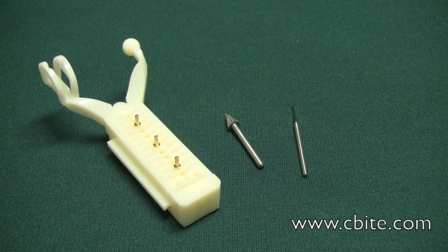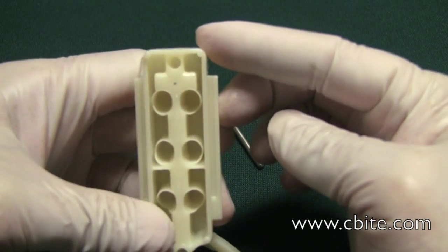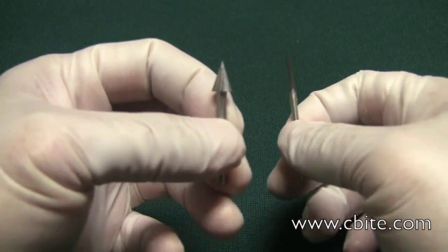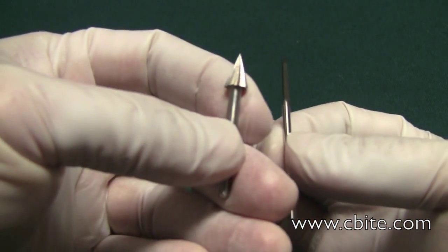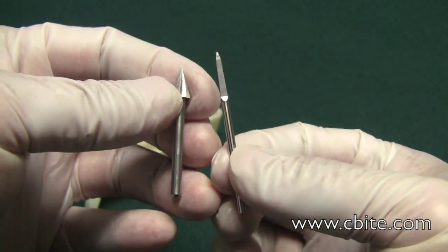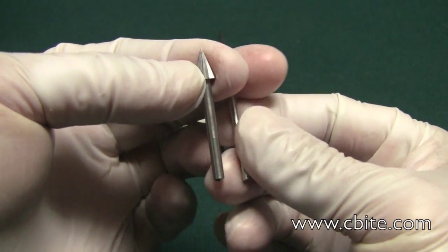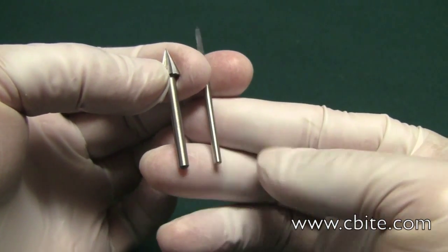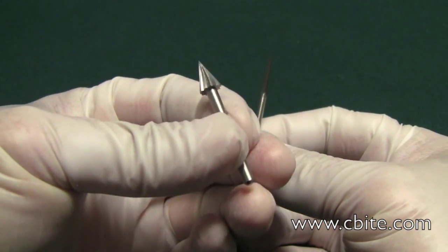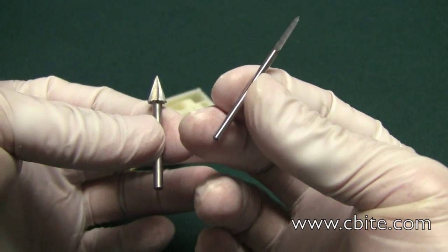These are the two burrs I highly recommend for making the holes on the underside for the ejector pins. The burr on my left is a Dremel bit — you can see the shank is definitely thicker, it's a one-eighth inch shank. The one on my right is a bit for the straight handpiece — the shank is definitely thinner. You can't interchange these; this will not go on the straight handpiece, and this will not go into the Dremel handpiece.